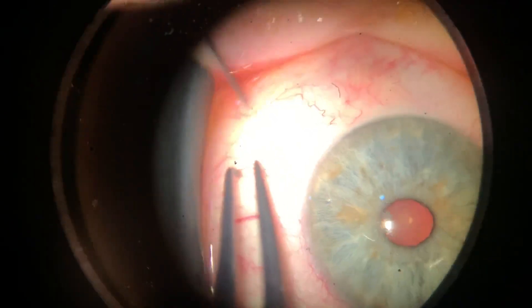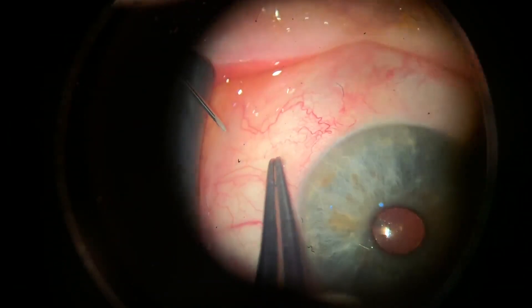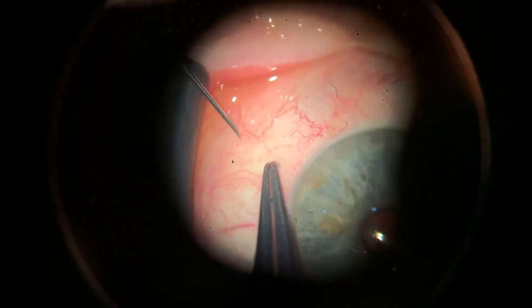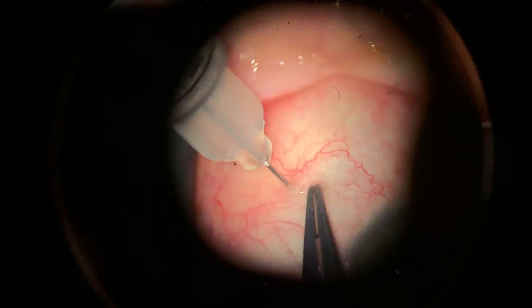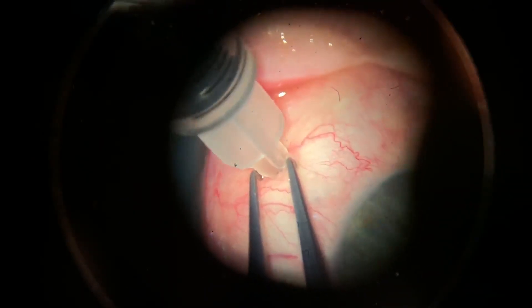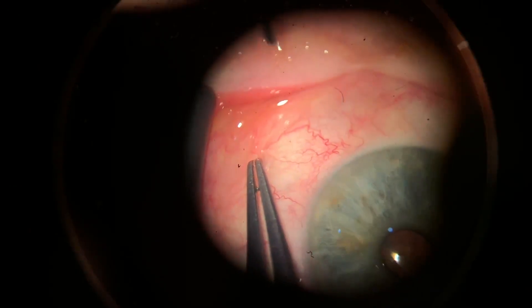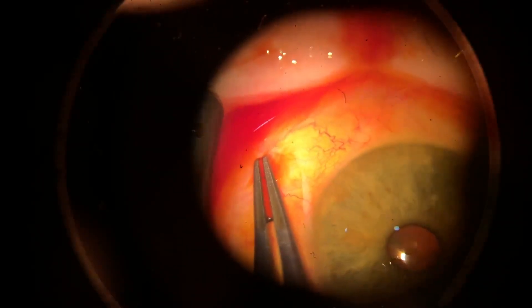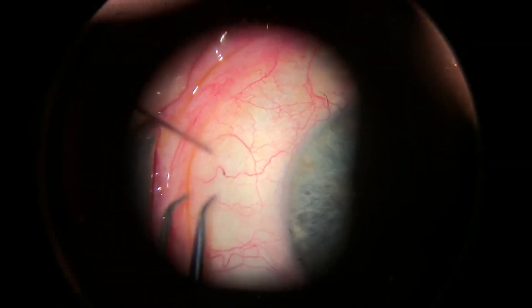On this video, we can see how to make an intravitreal injection. First, we shift the conjunctiva from the point of incision. Then we place the acute edge of the needle in the meridional direction, parallel to the middle and deep scleral fibrils, and easily penetrate into the eye. And there is no vitreous reflux at the end.